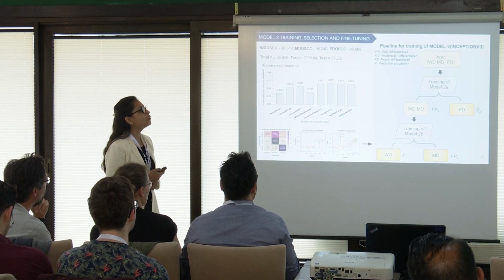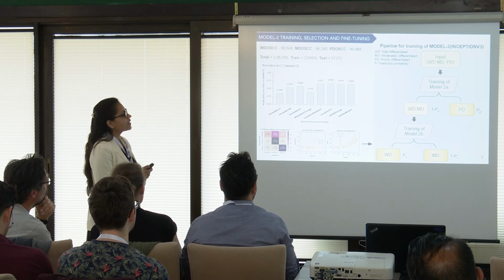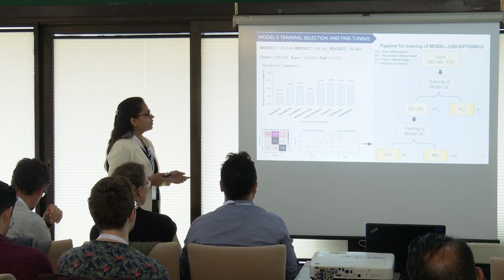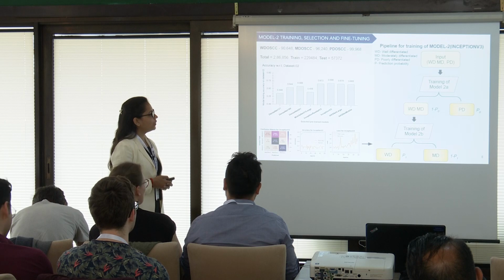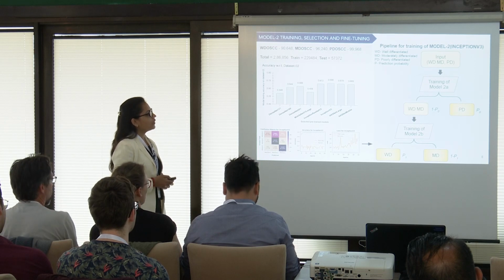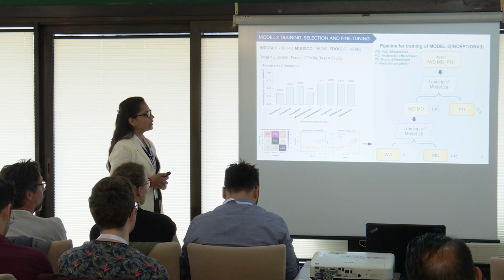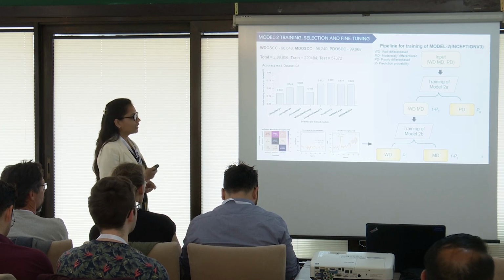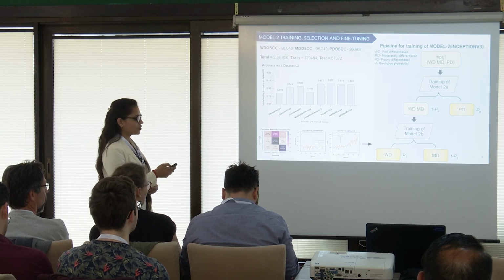That was the point when we decided to incorporate an ensemble deep learning algorithm. On the right side is the pipeline for the same algorithm, in which we thought to insert another model, model 2b. First, model 2a will differentiate and give output as poorly differentiated. Then the rest of the output will become the input to the training of model 2b, where it can now differentiate between the well differentiated and moderately differentiated.